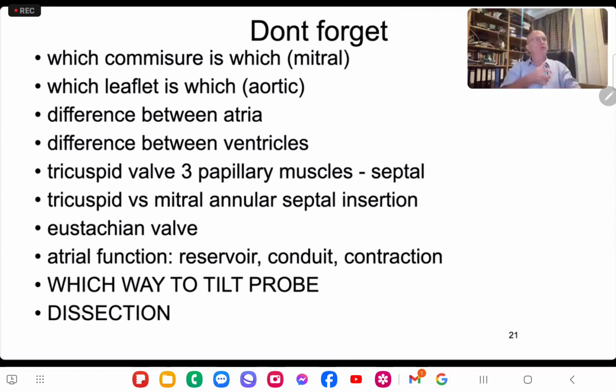So my question would be, as you tilt the probe, what things do you see and why? Where is that sheet of ultrasound going as you lift the tail of the probe? This ultrasound is going more towards the head, more towards the feet, and so on. So I think that would lend itself, it's not happened yet, but I think would lend itself very nicely to a question to identify people who've done a lot of echo.